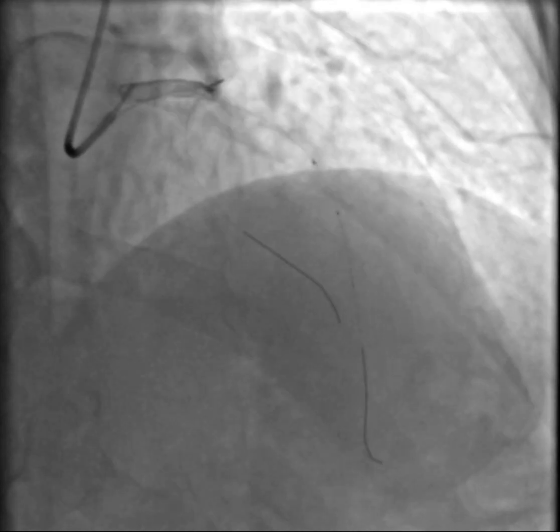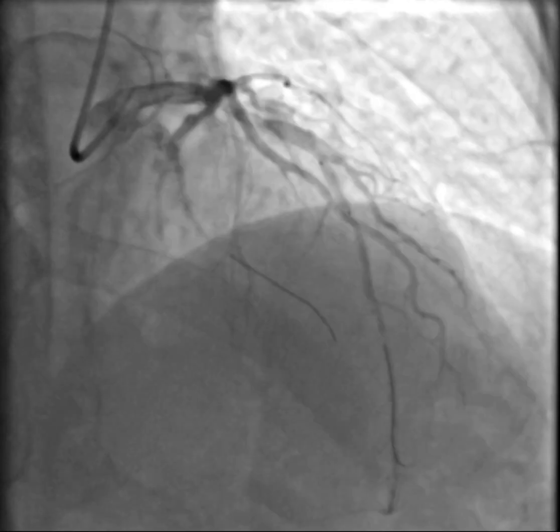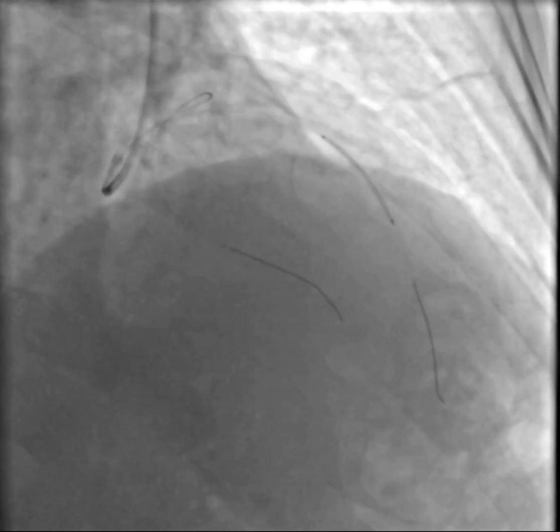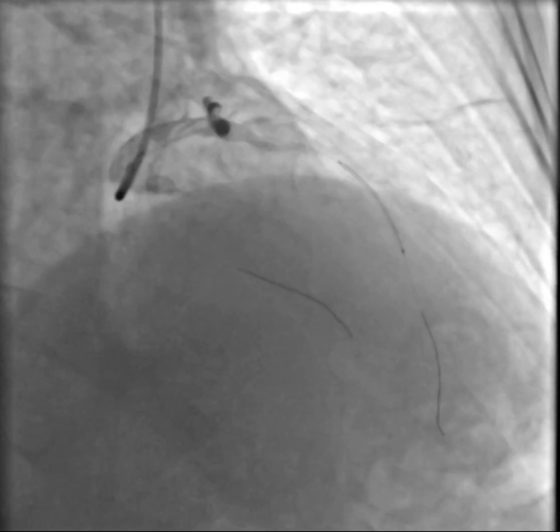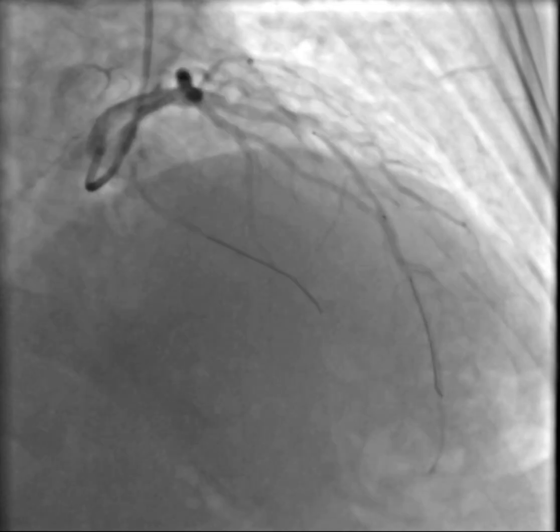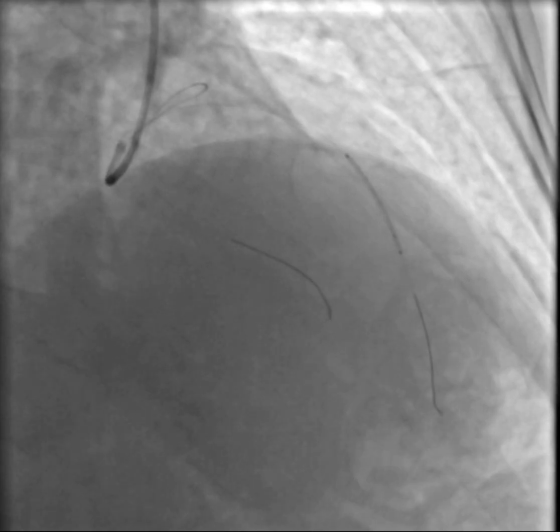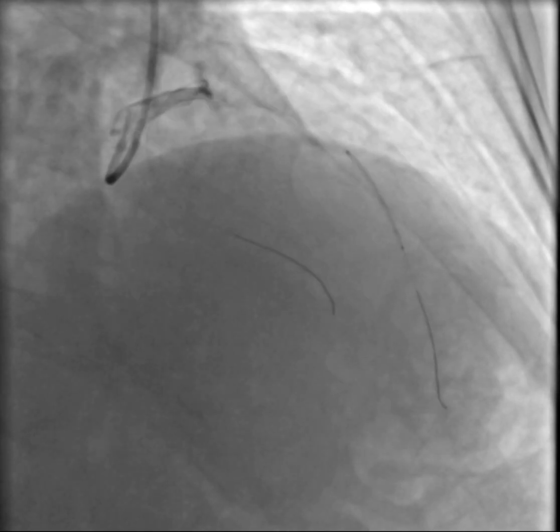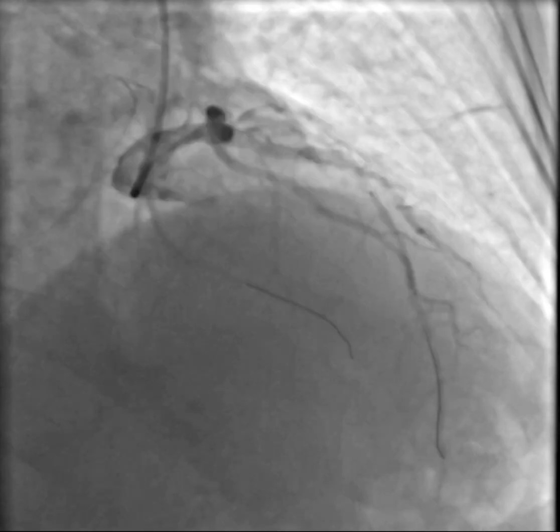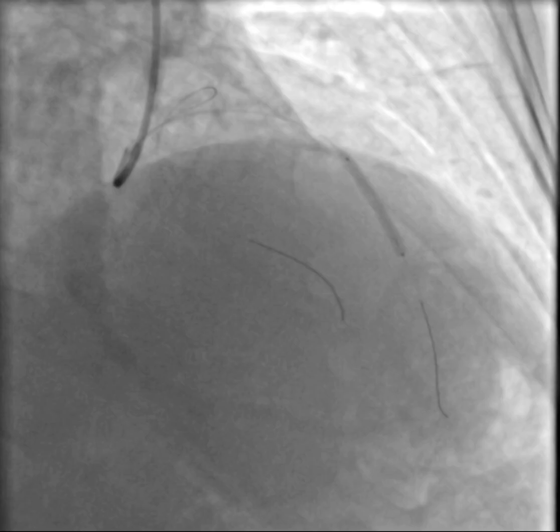After that, we quickly wire the LAD. Then we advance the balloon to the lesion located distal to the diagonal branch and perform balloon dilation there. Then we deploy an appropriate size stent at the LAD lesion site. Here we inflated the stent.